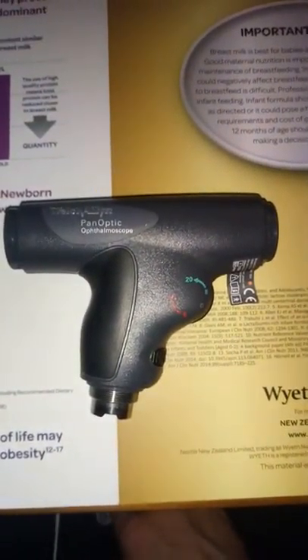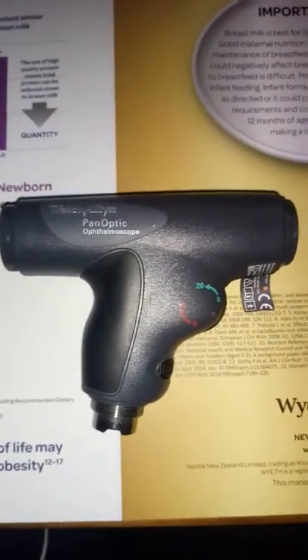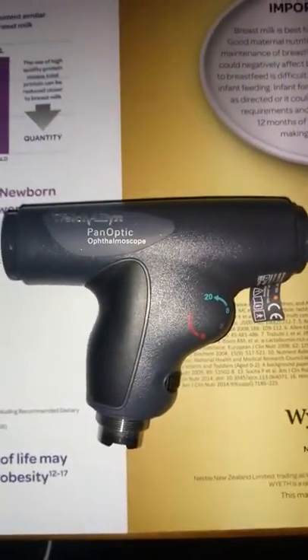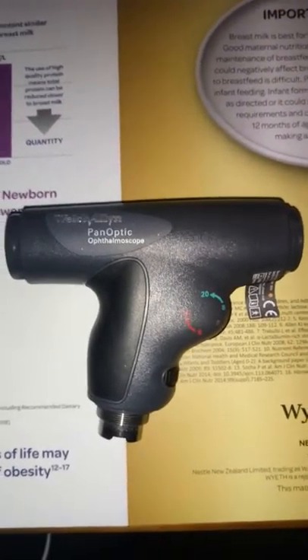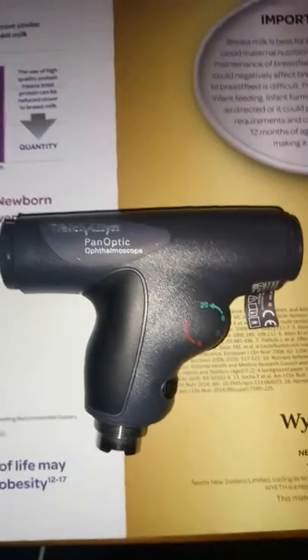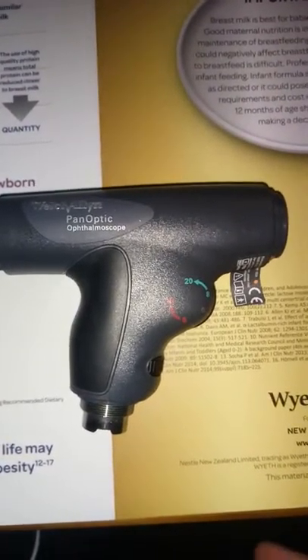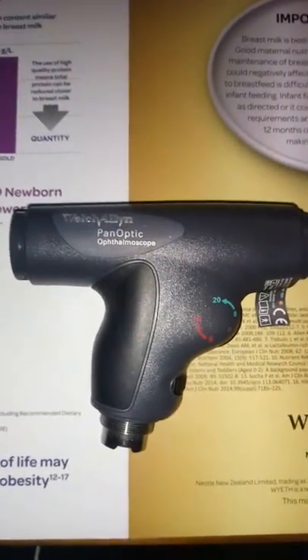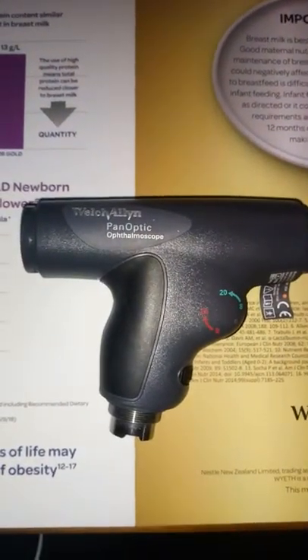I thought I'd just quickly show you an issue I had with the Welch Allyn PanOptic Ophthalmoscope and how I fixed it. I could not find a single schematic or picture or any information online or from Welch Allyn. So first, along with the disassembly, this has taken me a long time of fiddling around.